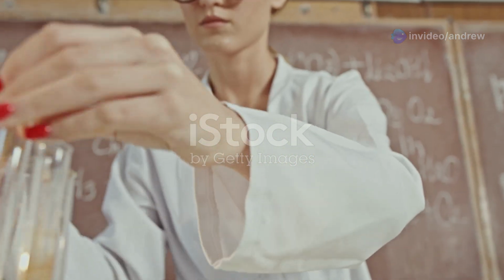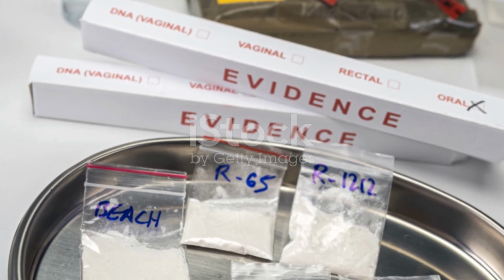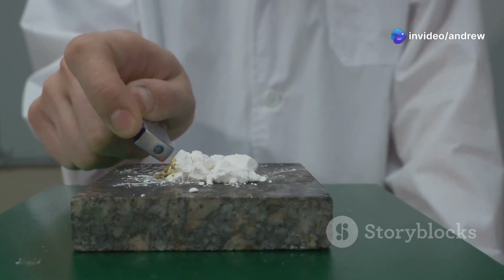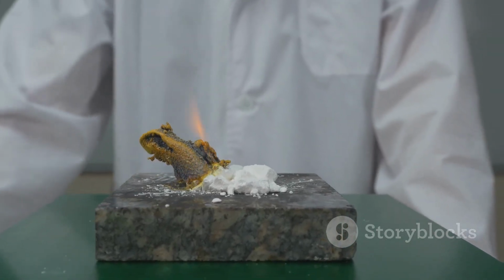The Scott reagent test is a valuable tool used in forensic drug analysis to presumptively identify cocaine. It is a color test, meaning that it relies on a color change to indicate the potential presence of the target drug. The test is relatively simple to perform and requires only a small amount of the suspected substance.